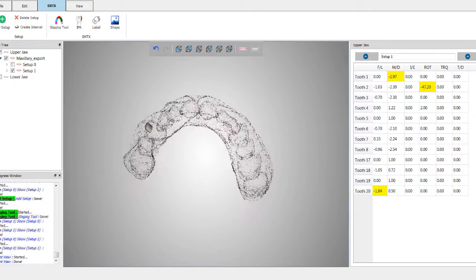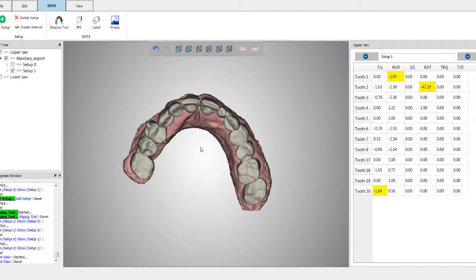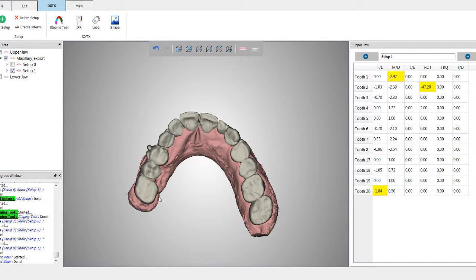When we're doing a lot of space closure and a lot of tooth movement, sometimes the gingiva gets a little wavy like this. It just isn't a problem when we actually make the aligners, because again, we cut the aligners right across the zenith of the gingiva. I just have never had it actually become a problem with the eventual fit. So just remember, we cut the aligners basically at or 1 millimeter below the zenith of the gingiva. Do not scallop, but just a straight cut.